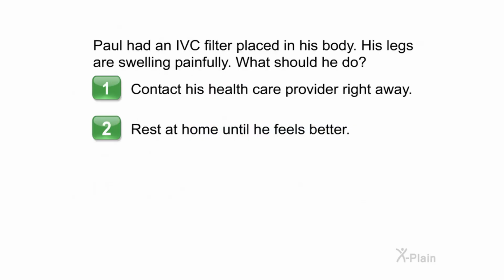Paul had an IVC filter placed in his body. His legs are swelling painfully. What should he do? Choose one of the following options. 1. Contact his healthcare provider right away. 2. Rest at home until he feels better.